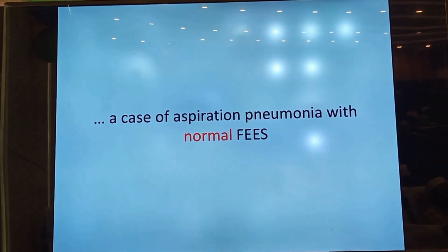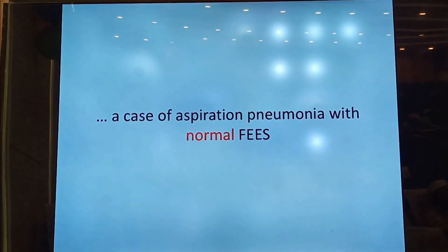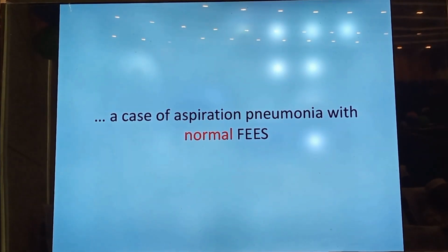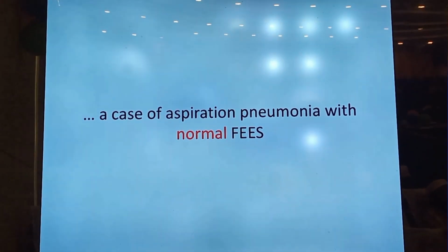And I'm just going to end this section of the talk with a case example of a patient who has aspiration pneumonia. So the food bolus and the liquid is going into the chest, but the FEES is normal.